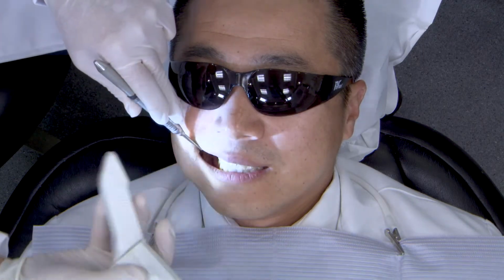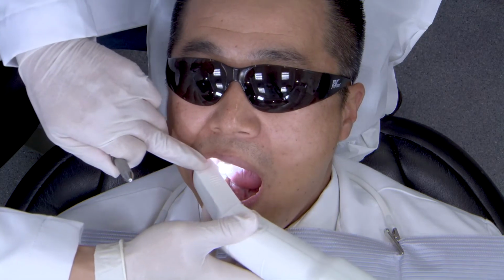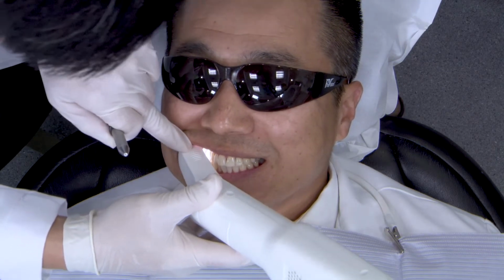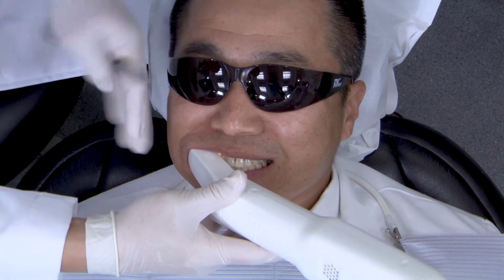So we'll first ask the patient to open. Go ahead and open all the way. Perfect. And then we position the scanner against the cheek and now bite all the way down together like we did earlier. So we get them back into that same position that we practiced with. And now I'll take it a step further and now bite down with pressure.